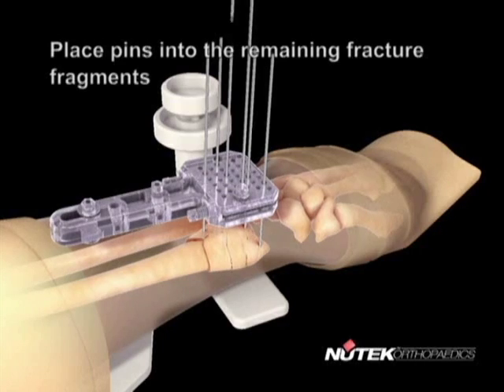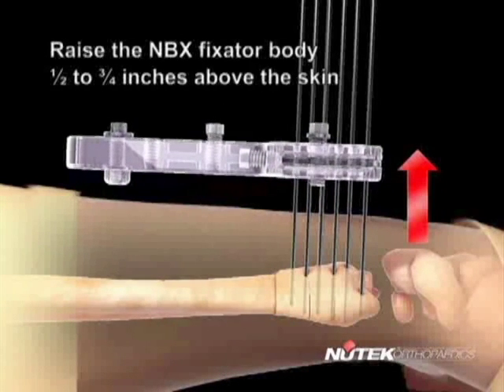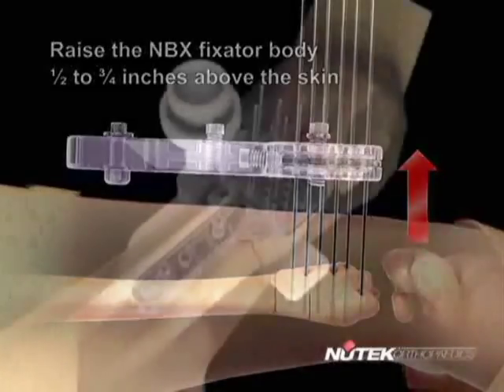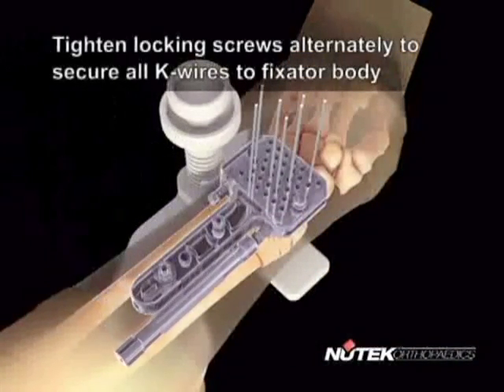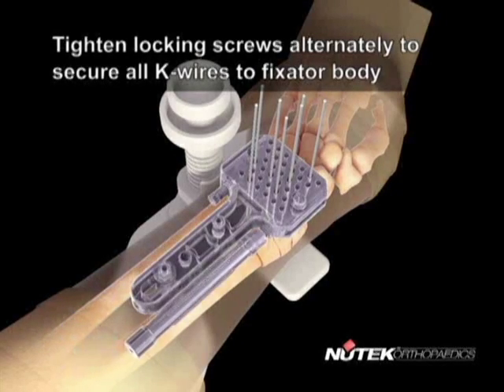Place pins into the remaining fracture fragments. The pin tips should barely penetrate the volar cortex. Raise the NBX fixator body 1/2 to 3/4 inches above the skin. Tighten the locking screws alternately to secure all the K-wires to the fixator body.